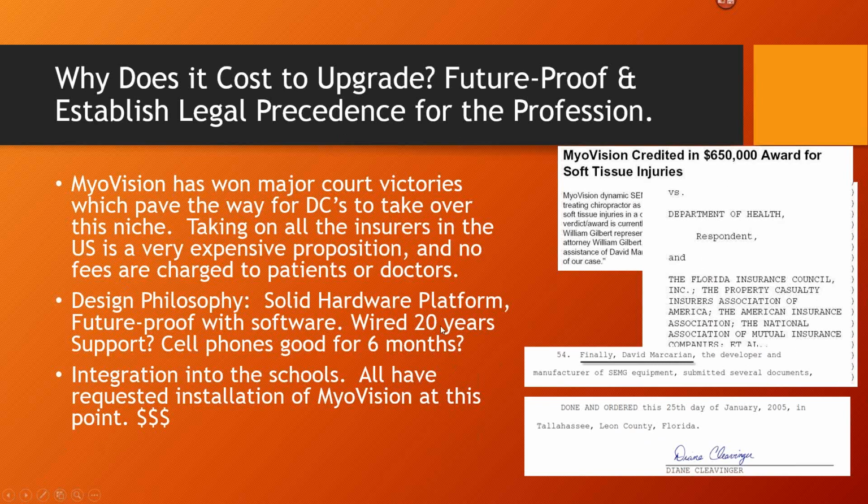You pay a little bit of money for the software, but you end up with this complete new product. Software updates, though, are free for a year. Those are the ones where we're making bug fixes and changes that are minor. But major upgrades, like putting in the interpretation report, are very expensive to do. I don't want to leave you hanging without developing new stuff. I want to continually develop new stuff, and it does cost a little bit of money.